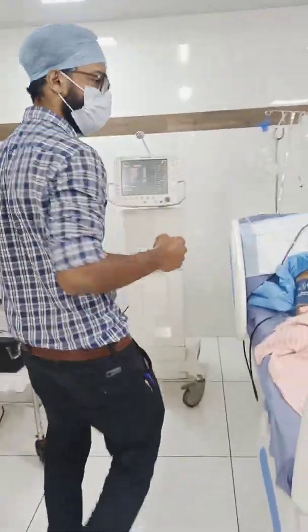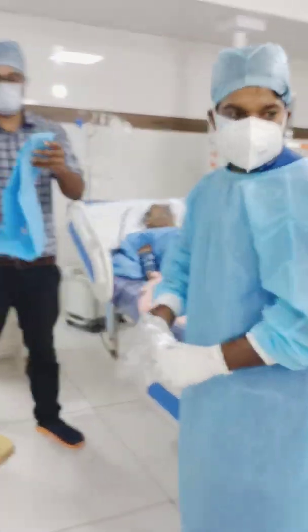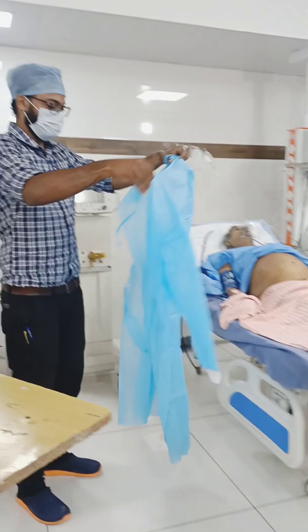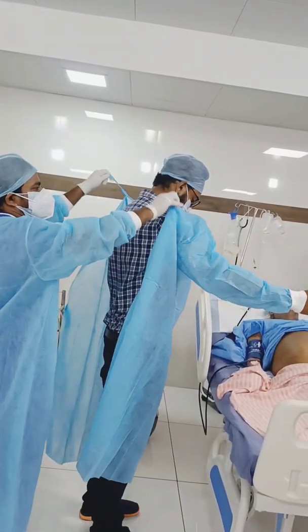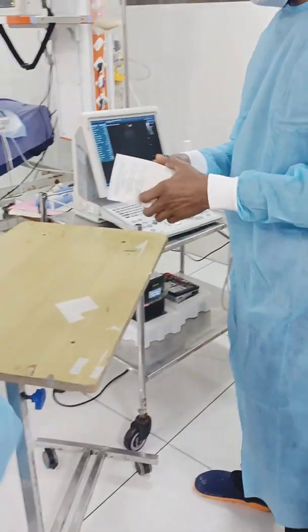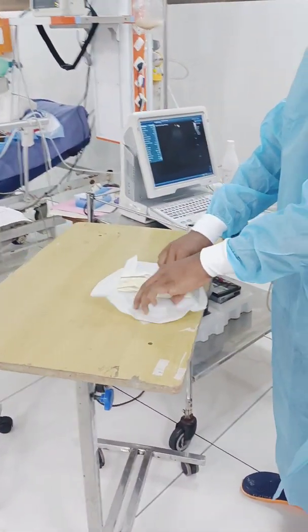After knowing the landmark where I'm going to prick, I went to wash my hands, and now I'm going to wear a sterile surgeon's gown and put on sterile surgical gloves.